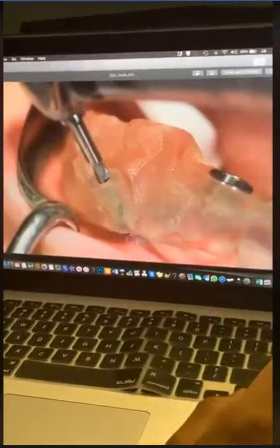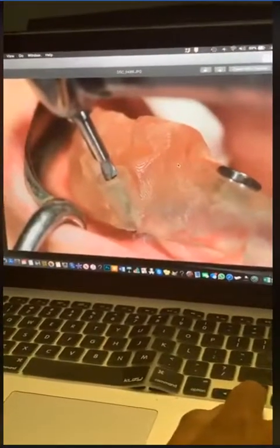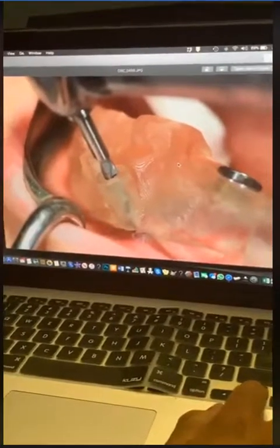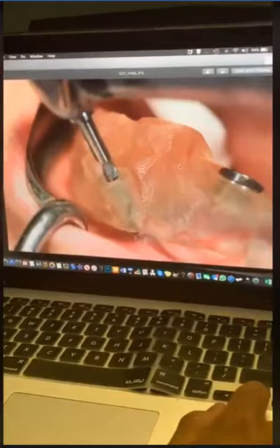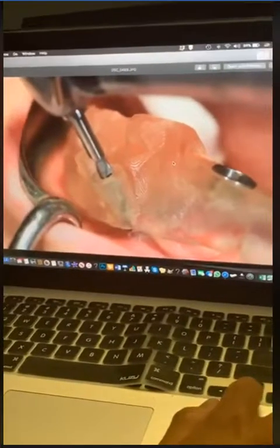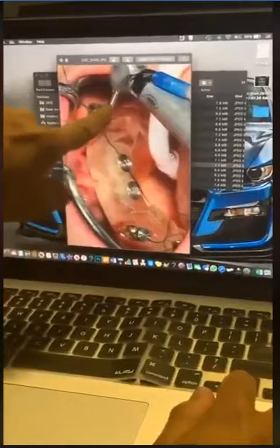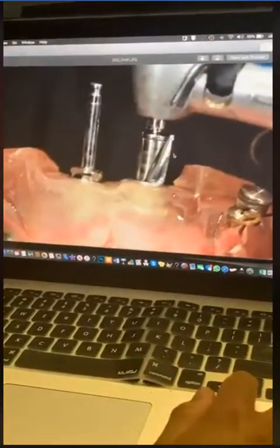When you keep things simple, a patient is happy and they're thrilled about it and they call you and you call them up the next day and you ask them how they're doing and they're doing fine and have zero pain. That's the key. So here is my 2 pins. The last one is going in.